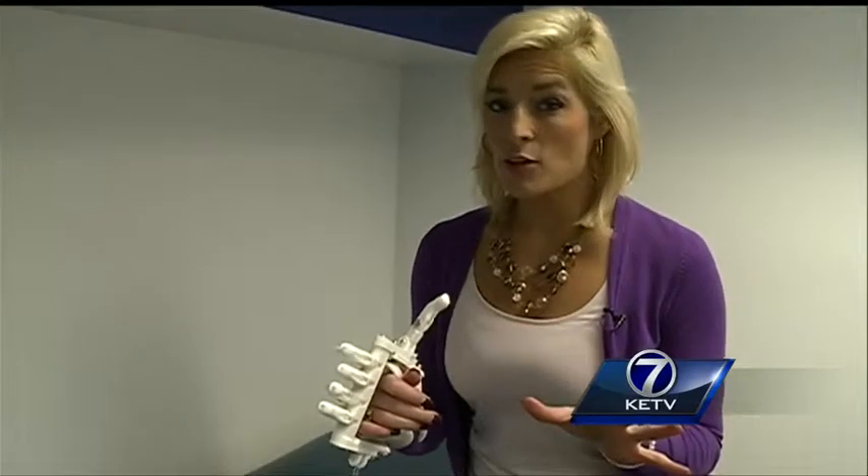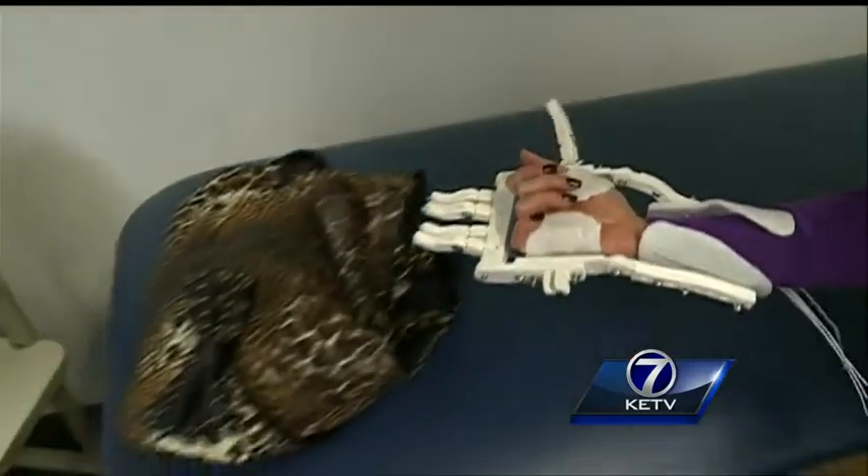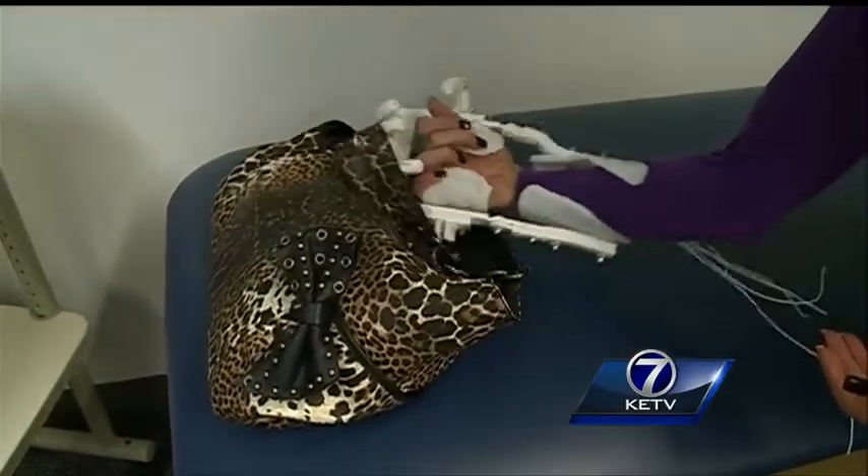Dr. Zuniga says with about $50 worth of material, he can make one of these mechanical hands. Obviously my fingers are in the way, but you see it serves as a basic function, and it will serve Adam immensely.